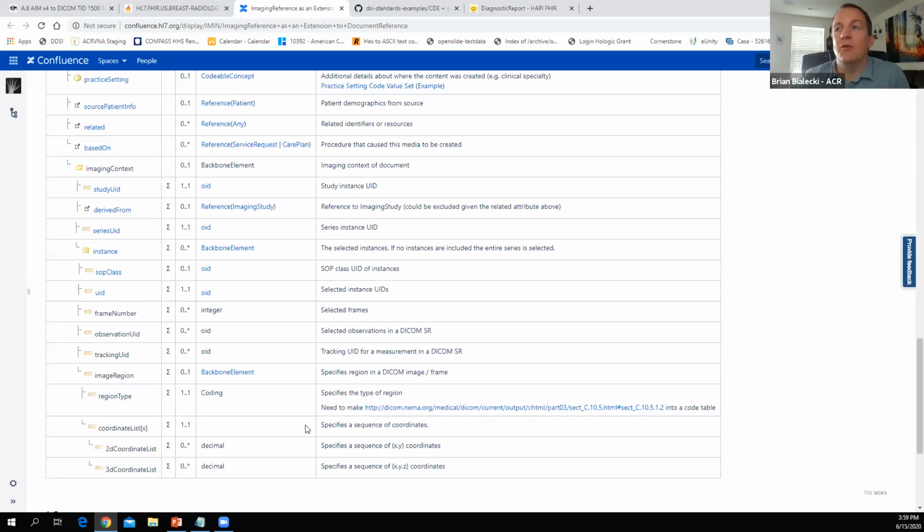I'm talking about a volume that spans hundreds of instances, where it's just subsets of pixel data inside of it. If I segment out a liver and I want to talk about the liver, right now the way that I've done this is I can specify an arrow or a bi-ruler or a ruler, but I'd like to go further. Is this the way to go? If I want to go that much further, is there something else people have seen that they think might be more useful? Some prior art.